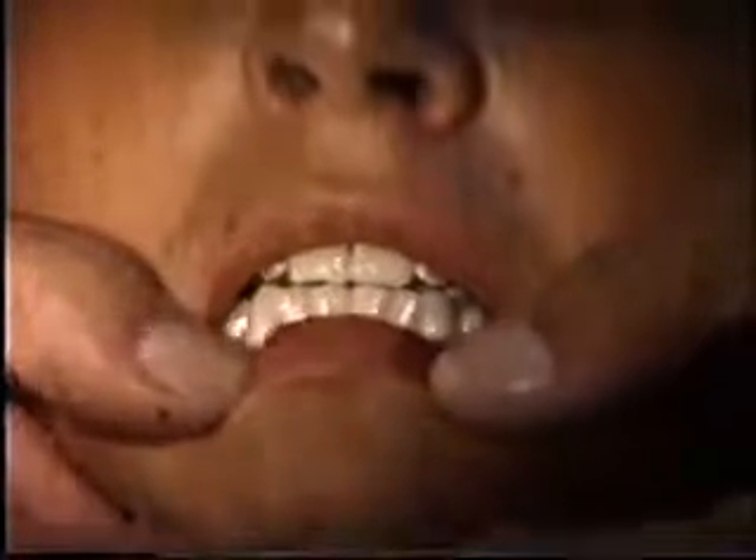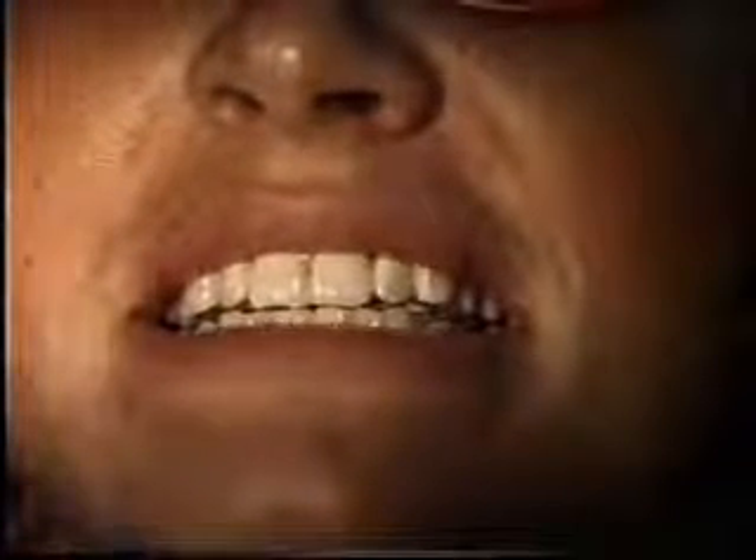Now close. You feel it sliding right in there? How does it feel to you? It feels about the same as what you had before, just with the plain bite splint. Now close again. There's a tendency for the jaw to slide back, but as she hits the incline, she'll slide forward. She had relief of a lot of the symptoms when she was wearing it more, but as she wore it less because of the difficulty in speaking, the symptoms seem to return.